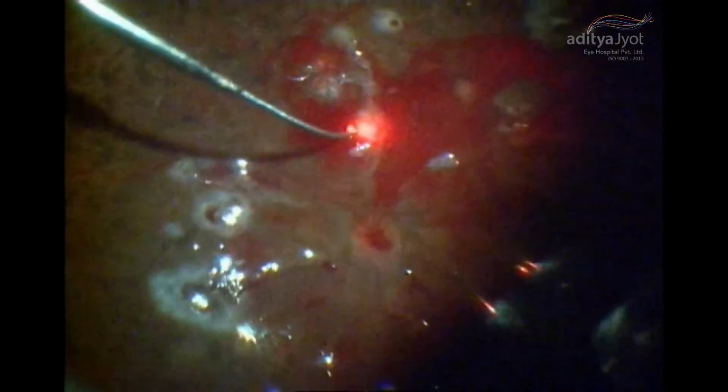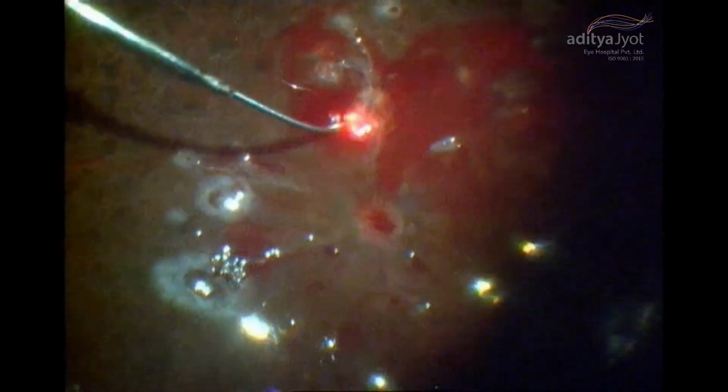So the idea of the peripheral laser is to do a fill-in panretinal photocoagulation, and the idea is to treat all the ischemic areas of the retina, and make sure that all things are done to reduce the recurrent hemorrhage. And at the end of the surgery, you are using silicone oil. So silicone oil air exchange is being done, so that even post-operatively visualization is easy for the patient. And if you require a fill-in laser photocoagulation, it can be done on the slit lamp or indirect ophthalmoscope post-operatively.